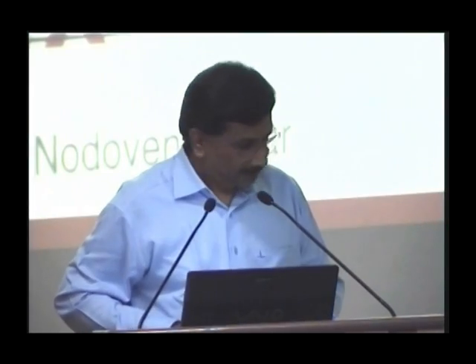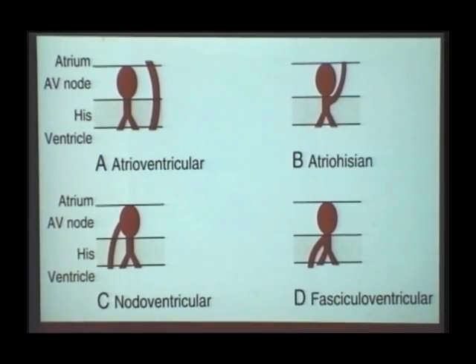Briefly look at the other important cause of QRS widening. What is the other important cause of QRS widening? Yes? So before we go, we'll pre-excite you, right? So that you go with some excitement. So this is pre-excitation syndromes.